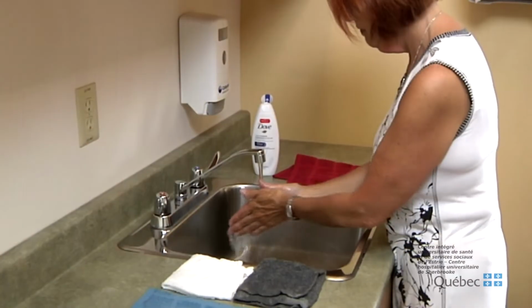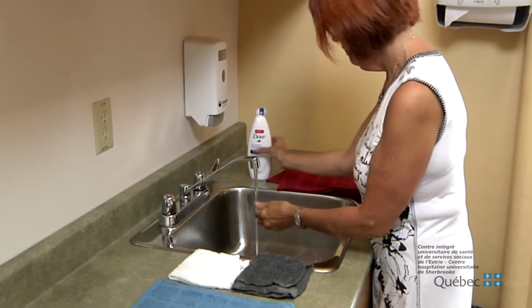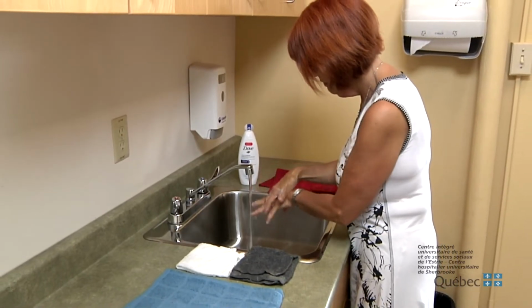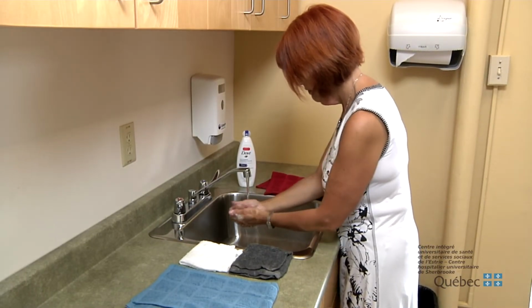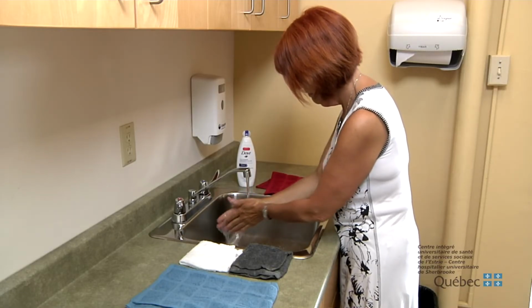Since you won't be using disinfectant or gloves for this procedure, you need to make sure that your hands and body are clean at all times in order to reduce the risk of infection. Once you have gathered all your materials together, wash your hands with liquid soap. Lather your hands and then scrub them for 20 seconds, making sure you clean between your fingers, the backs of your hands, and under your nails. Rinse your hands for about 10 seconds.